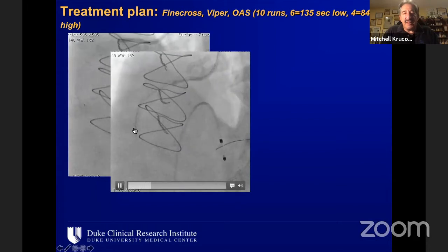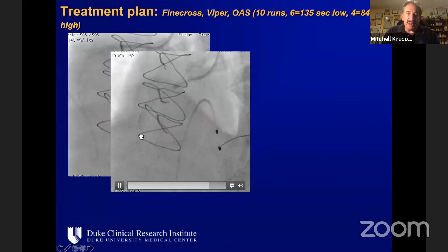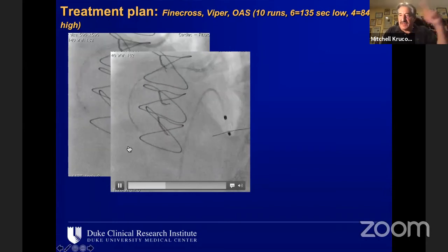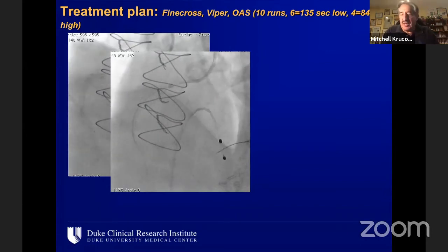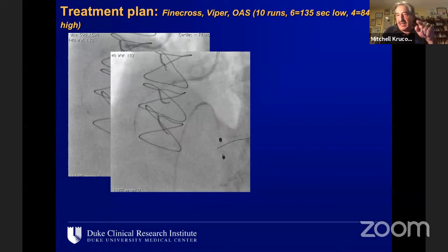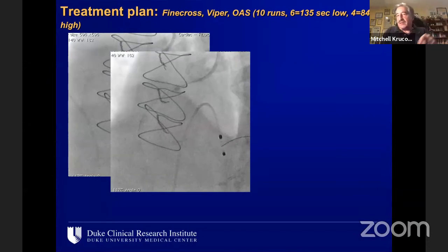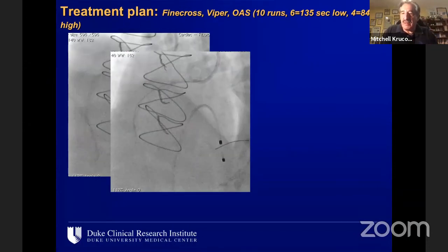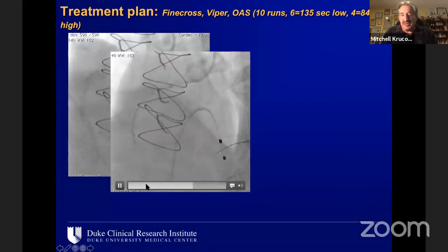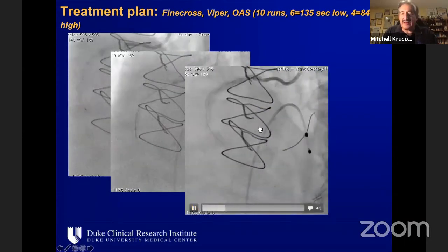So this is the orbital atherectomy device. You can see there is a part of the nose cone distal to the cutting surface, and then the bulge right here is the actual cutting surface that is going around in the lumen of the vessel. The other nice thing about eccentric cutting, rather than plugging the lesion like a rotablator does, is with orbital, with eccentric tissue ablation, you actually have perfusion around the device while you're working. So we've got good guide support, good reach, and you can see we're able to do quite a bit of tissue ablation throughout the course of this vessel.